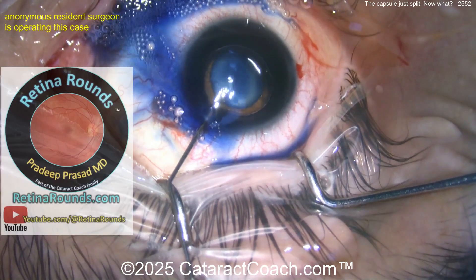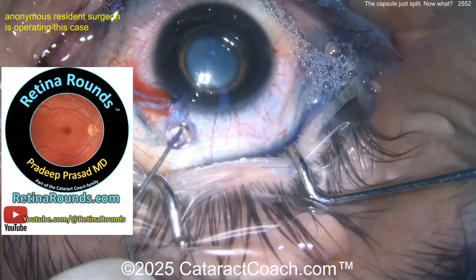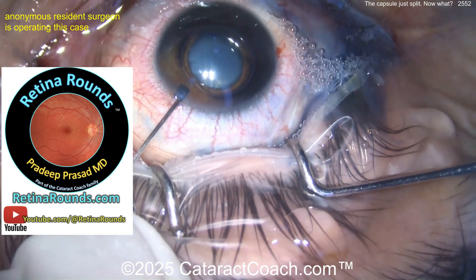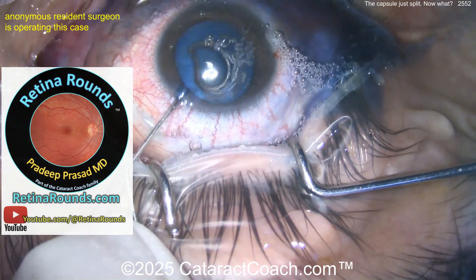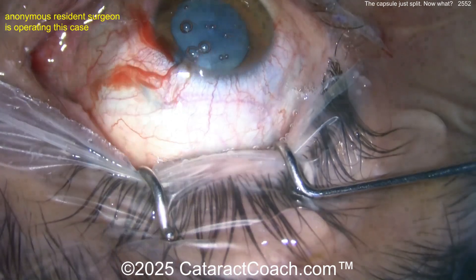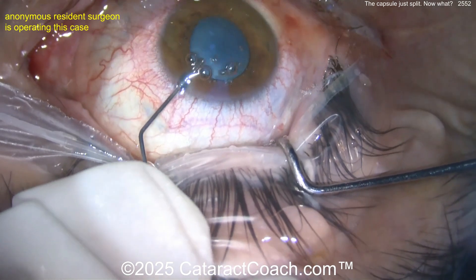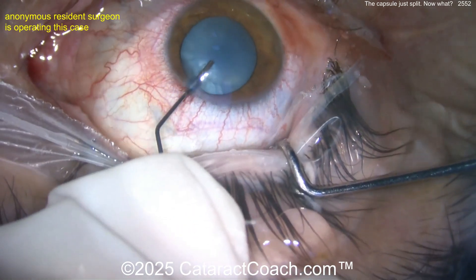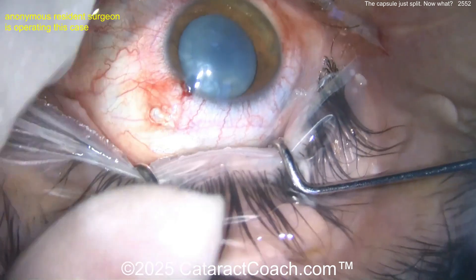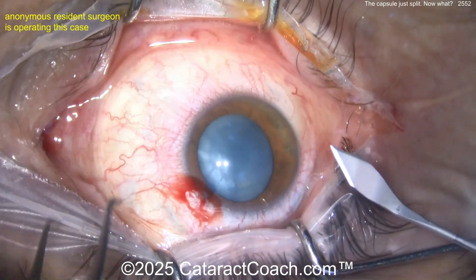And now trypan blue dye to follow. Now here comes the viscoelastic inside the eye, checking the pressure — make sure the IOP is nice and high.